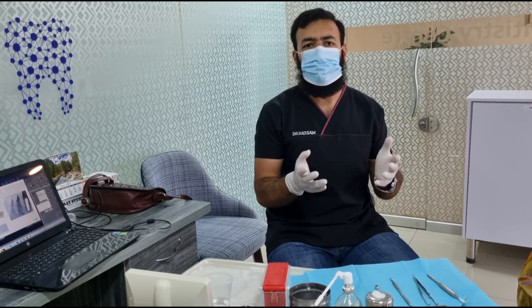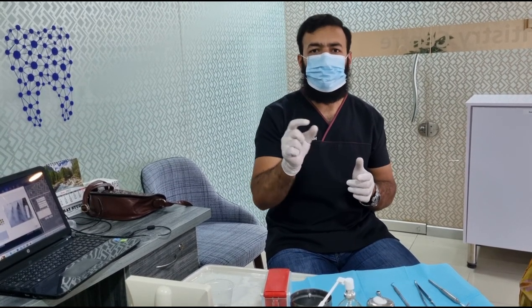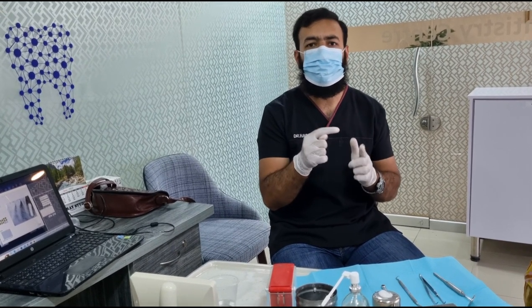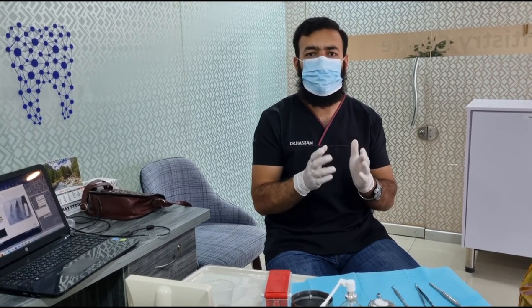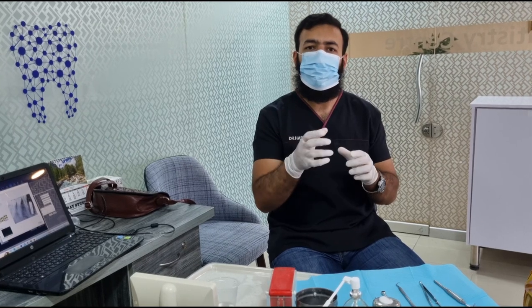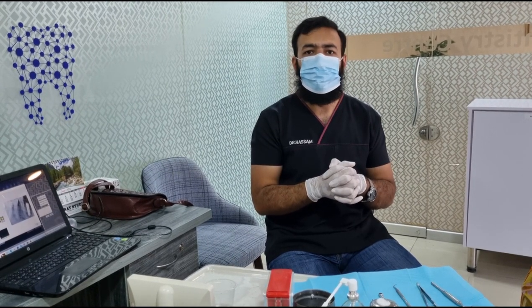The first step is that we have to identify the location of the implant. Generally, when a single missing tooth is being replaced, you know the implant will be in the center of the mesiodistal width of the edentulous space, but you have to make sure so that you remove the tissue right above it. Give local anesthesia to the patient and when it's effective, insert a probe into the soft tissue until you hit the implant. With experience you will know the difference in tactile sensation — implant is metal and the probe is also metal, so you will feel a clean sound when metal-to-metal contact is made. Then take a radiograph with the probe inserted to adjust its position accordingly.